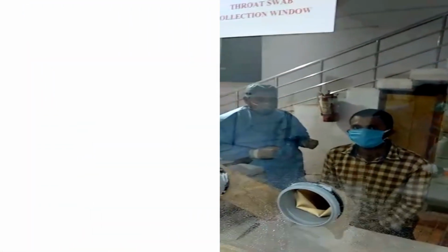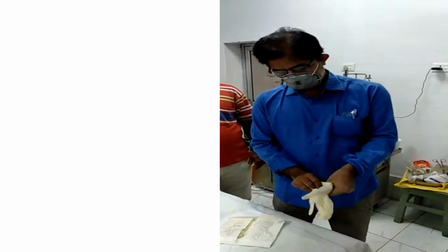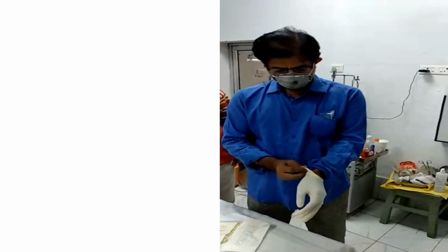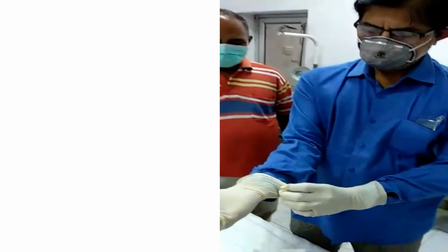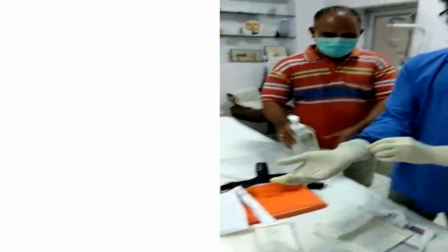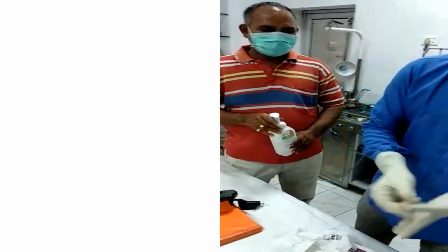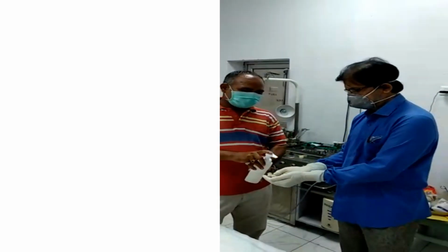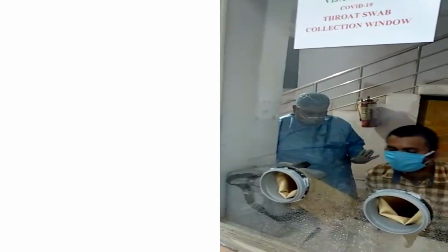So this is the second case for which the sampling will be taken by Dr. Ravikant again. So he's getting ready. He's almost ready. Sanitizing the hands with sanitizer. The patient is also ready. It has been sprayed another time.